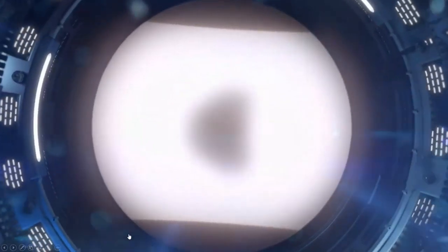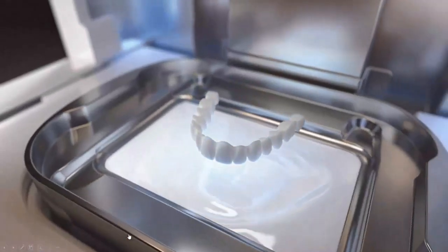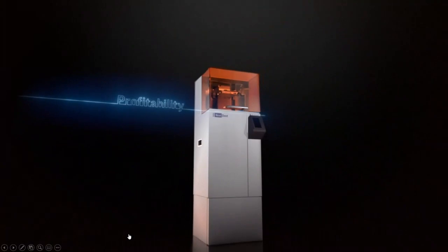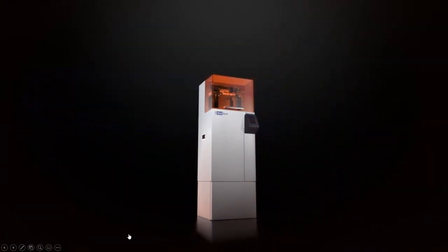We kick the series off today with a session on 3D Sprint, our nesting software from 3D Systems. As many of you already know, this software is of course much more powerful than just nesting, and we will address all these functions that 3D Sprint offers that will add value in your daily dental workflows.